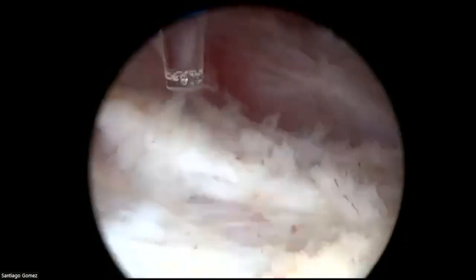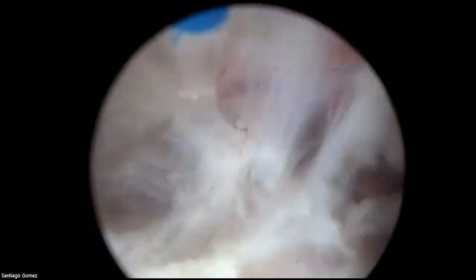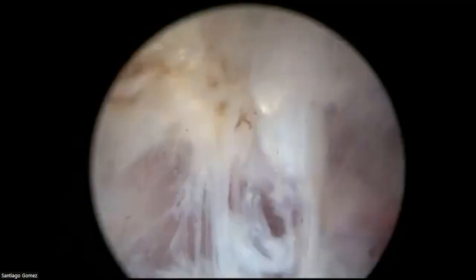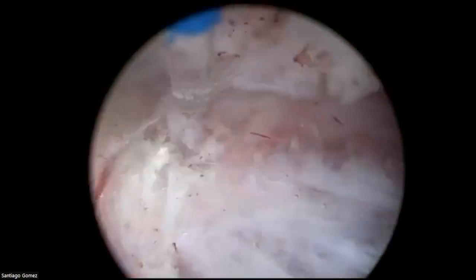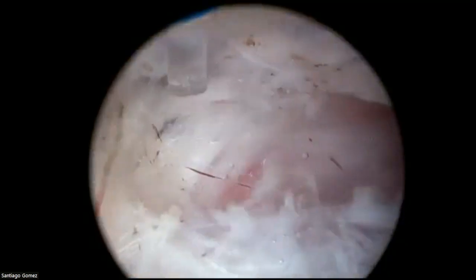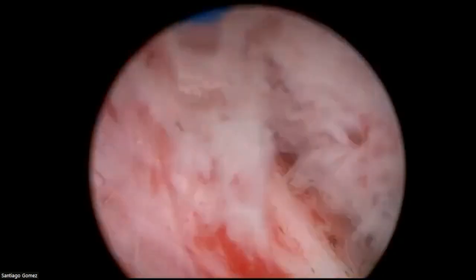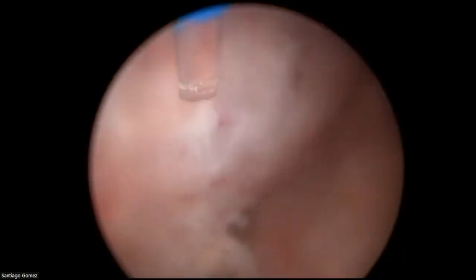Now, when we come down here to check how things are looking, we have a much better idea. You see, we understand much better now because there is more space and we can continue with our dissection, cutting the attachments that remain. And many people tell me, probably the prostate is so big that you cannot push it in the bladder. And I have to say that the trick to push the prostate en bloc to the bladder is to try to rotate the adenoma. You see, we have rotated this side.